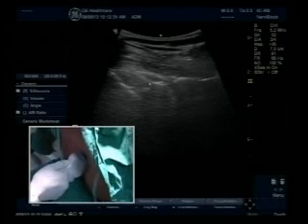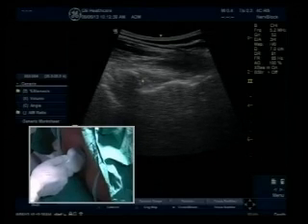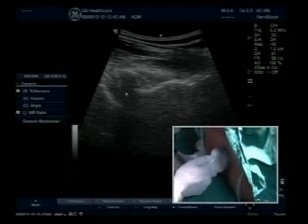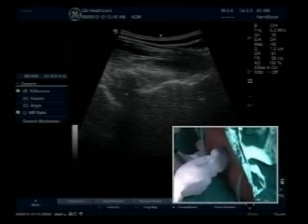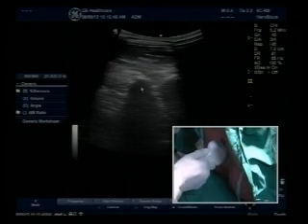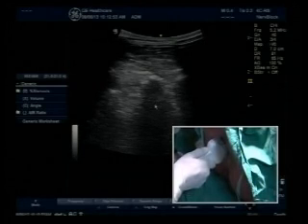I'm moving my probe up slowly. So the first structure I see, where you can see the black complete shadowing, where the pointer is now, is L5, because that's the first lumbar vertebra, isn't it? From down, I go up, I see L4. That is now coming into the picture. I'm getting it in the center of the picture, and that is L4, which will be complete hypoechoic.